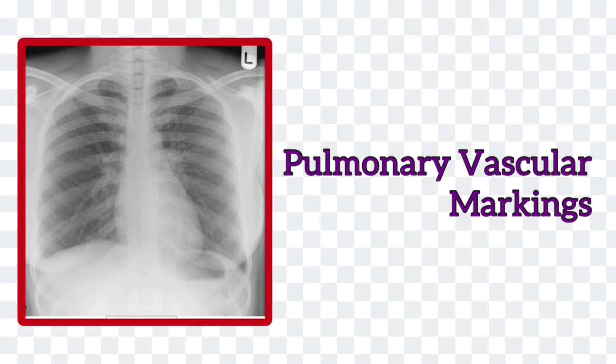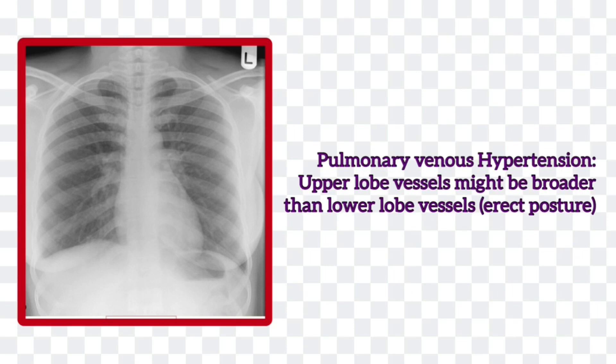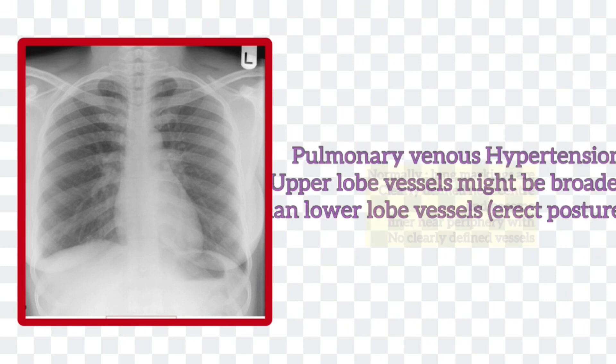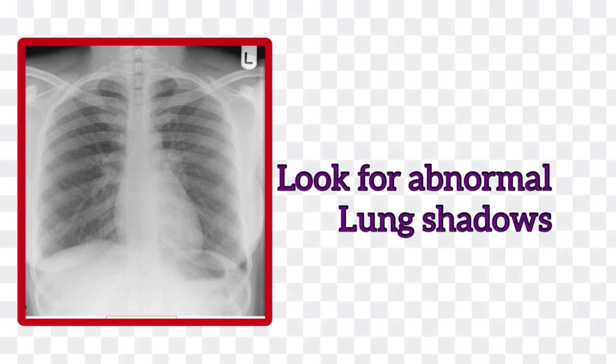Now look at the pulmonary vascular pattern. Normally, arteries and veins branch vertically to the upper and lower lobes. The upper lobe vessels have a smaller diameter than the lower lobe vessels in an erect chest x-ray — this is due to gravity. In pulmonary venous hypertension, vessels branching upwards become larger than those branching downwards. In a normal chest x-ray, lung markings are more clearly defined near the center and become smaller and more difficult to see towards the periphery. Look for any discrete or generalized shadows in the lung fields.